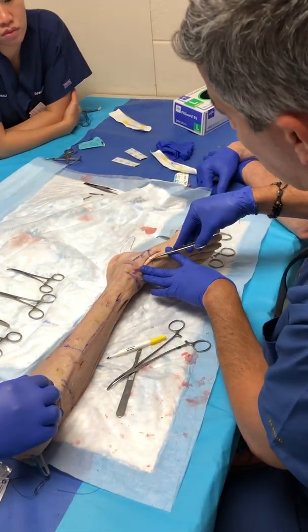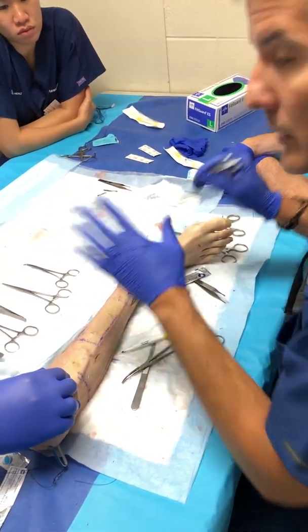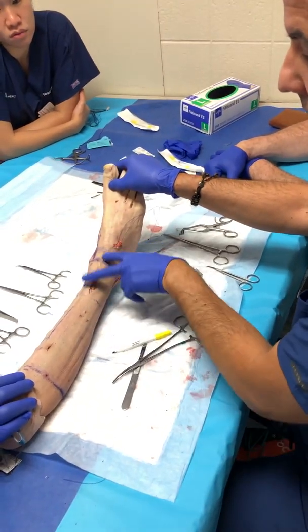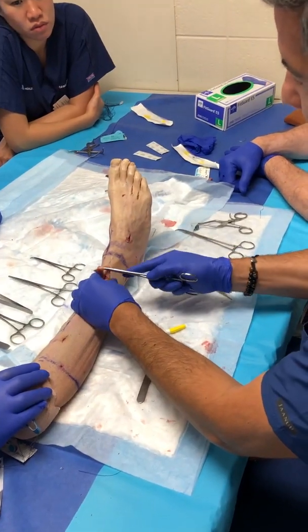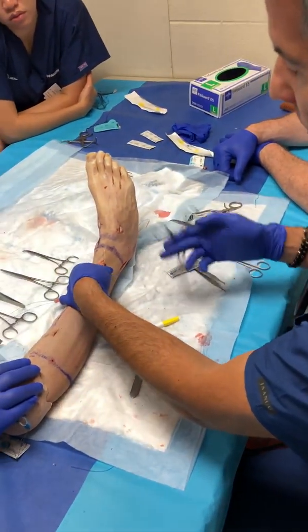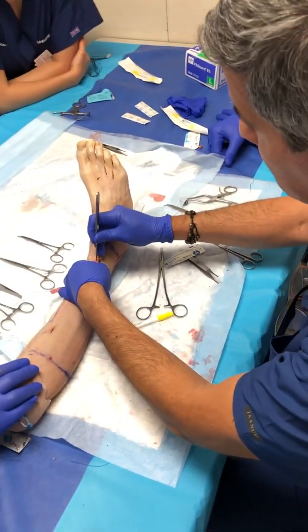So go like that, open up here, okay? We open a little bit more this way, okay? And you're gonna dissect it and transfer, but let's do the split, okay? Now, same dissection, 1.5 centimeters from the tibial crest, 5 centimeters above the ankle. What we identify that is, let me take this one out so it's not in the way. So that's your tibialis, okay? So what you're gonna do now, make a little tiny hole right in the center.